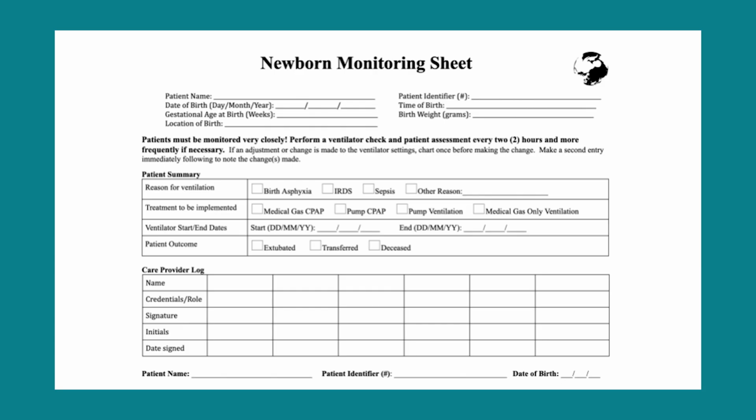In this video, we will cover the newborn monitoring sheet that has been provided with your NeoLife ventilator. The purpose of this monitoring sheet is to help the healthcare providers systematically document medical history, findings, and treatment. The first portion of the newborn monitoring sheet consists of patient information and identification.